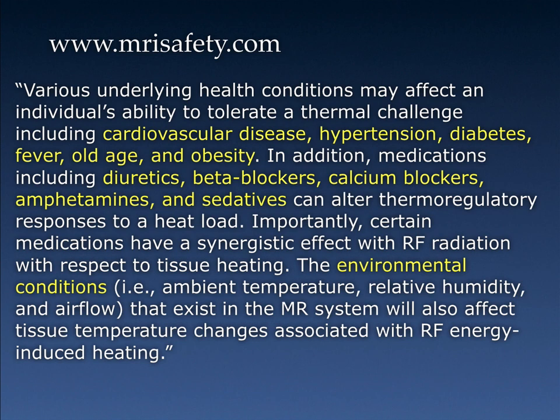Okay, so that is SAR. And SAR is estimated per sequence. So you could scan every sequence at 4 watts per kilogram.